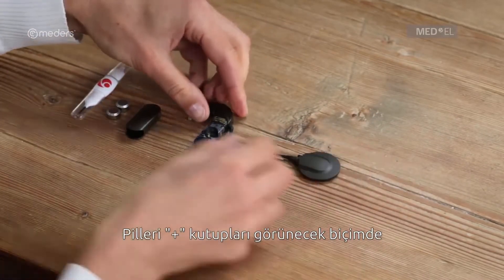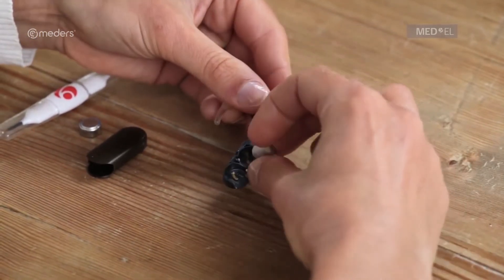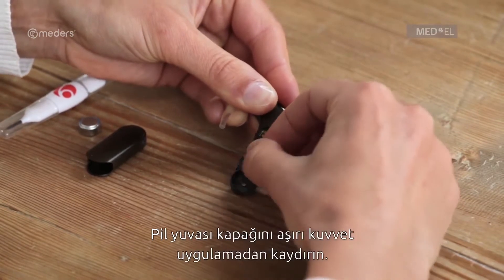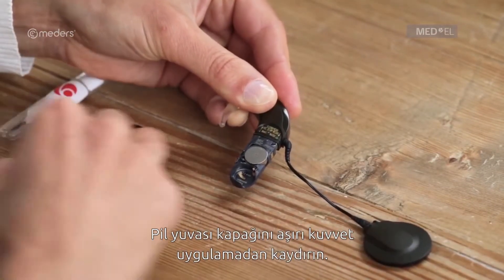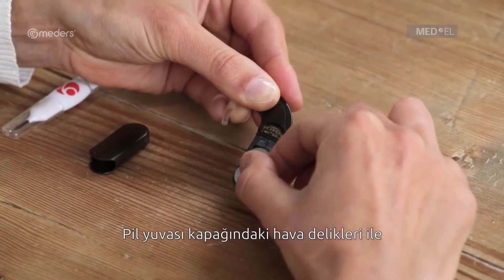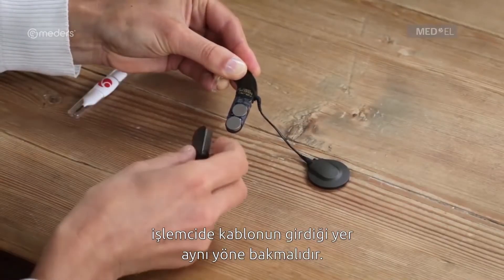Insert the batteries into the battery pack frame with the positive poles facing out. Then slide on the battery pack cover and be careful not to use excessive force. The air inlets on the battery pack cover should be on the same side as the coil cable socket of the control unit.